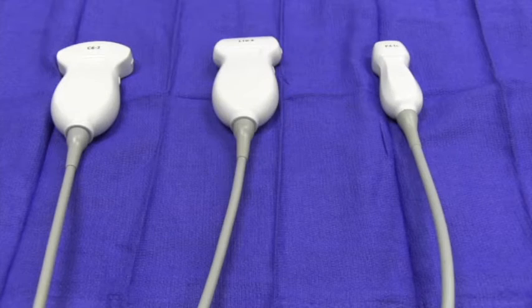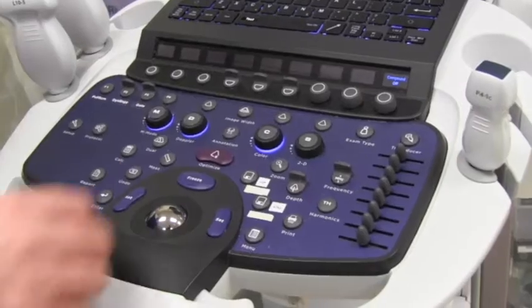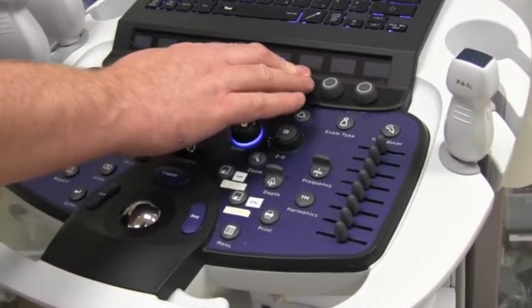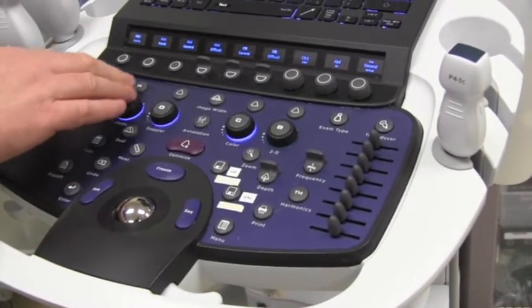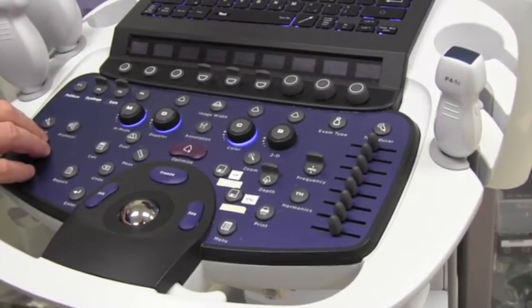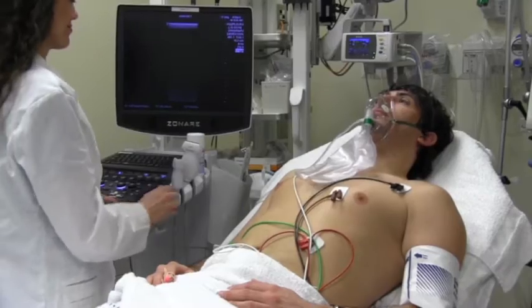Lung ultrasound can be performed with low or high frequency transducers. Divide the thorax into 4 areas to scan. If your machine has a lung ultrasound preset, select it. However, if your machine does not have a lung ultrasound preset, choose the abdominal setting. You must turn off any advanced image processing such as compounding or harmonics.